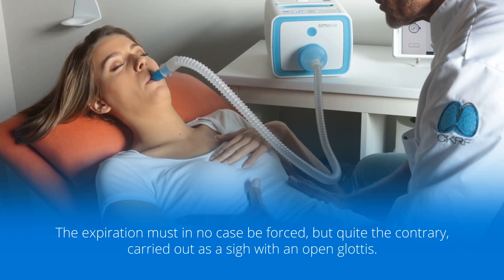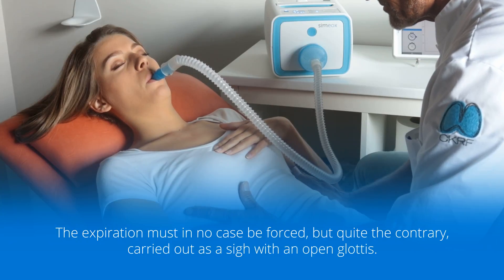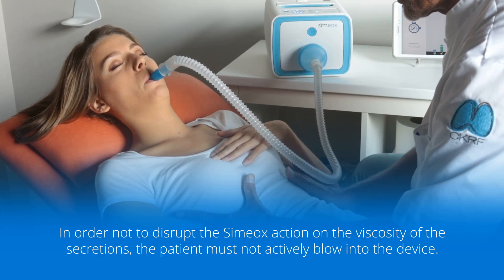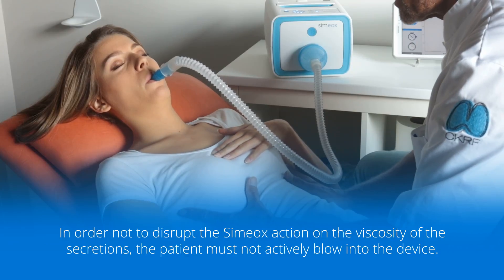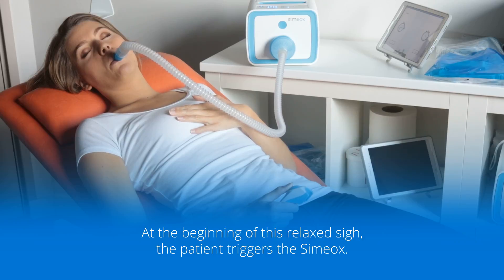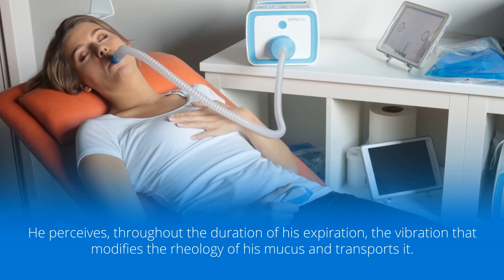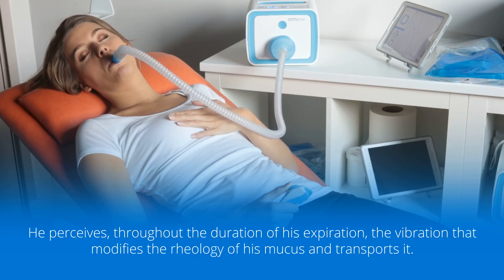The expiration must in no case be forced, but quite the contrary, carried out as a sigh with an open glottis. In order not to disrupt the Simiox action on the viscosity of the secretions, the patient must not actively blow into the device. At the beginning of this relaxed sigh, the patient triggers the Simiox.